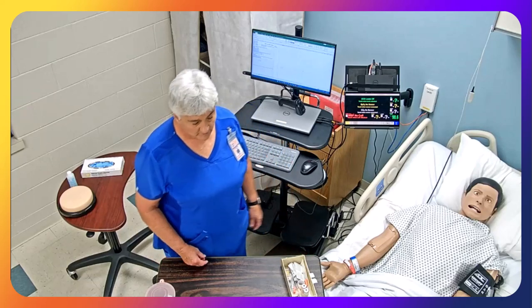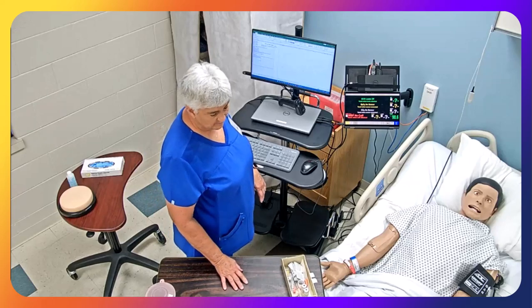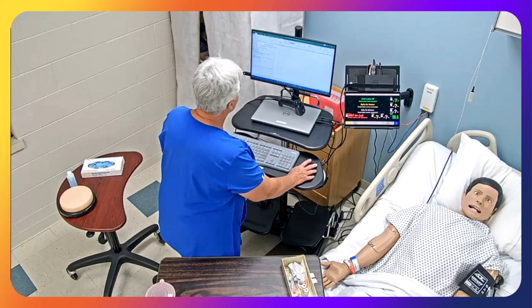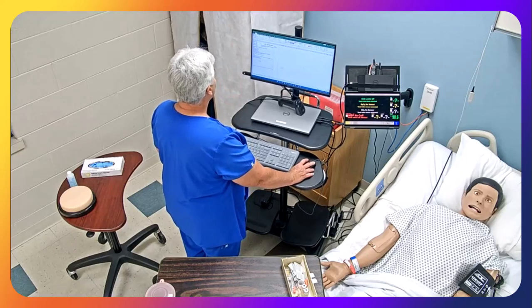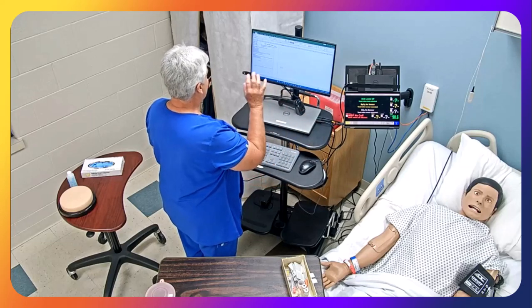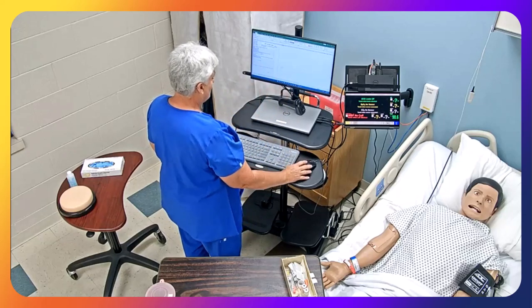Okay, this morning we're going to be demonstrating how to mix insulins, regular and NPH insulin. So I'm going to start at my nurse's station. At the nurse's station I'm going to pull up my patient's chart and make sure that my MAR matches what the doctor has ordered.